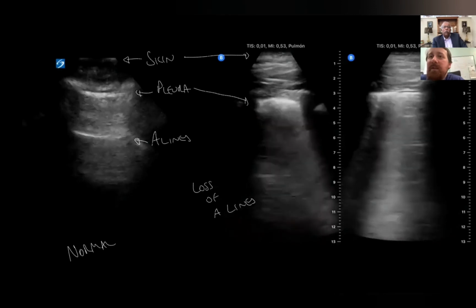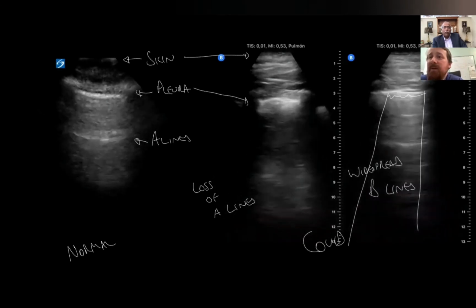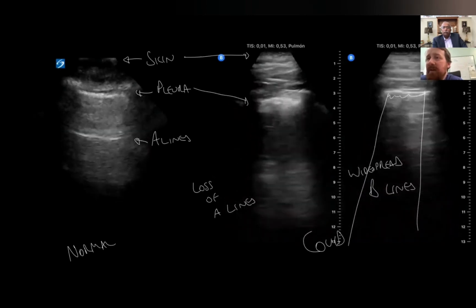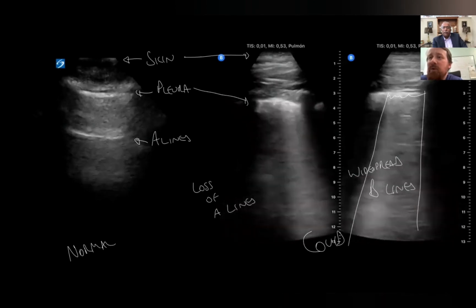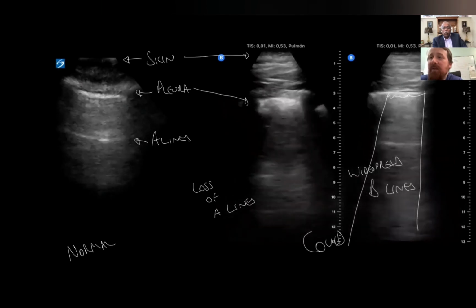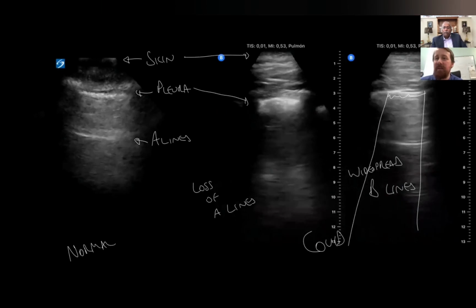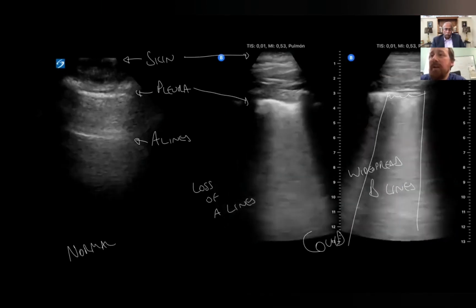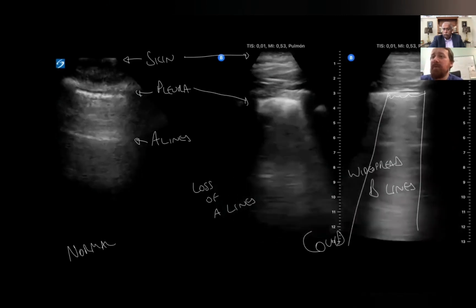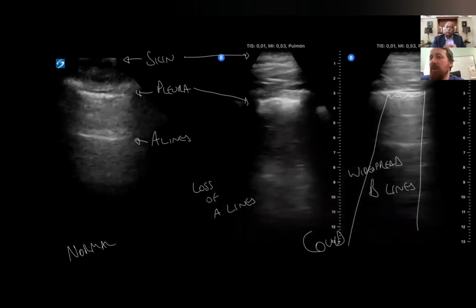And then we can see here, on the right-hand side, as you look at it, that we have an irregular pleura, okay, and you have these posterior B lines. So it's, as I said, like a torch being shone from the pleura, which is irregular itself, okay, and you get these posterior B lines. Now, in coronavirus, one of the typical findings is you can actually get these skip lesions, and so the B lines can merge together. And so instead of being one distinct area, it can be a few different areas appearing together that are then cast in this posterior line. And these B lines, as you can see, obliterate the normal lung architecture.